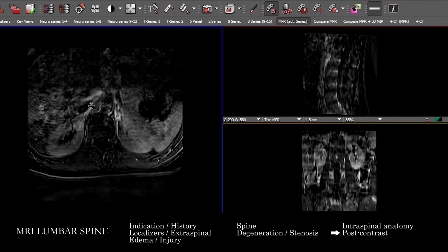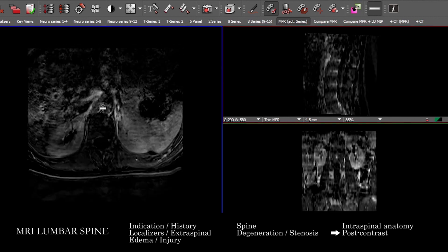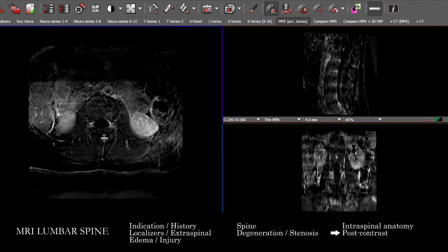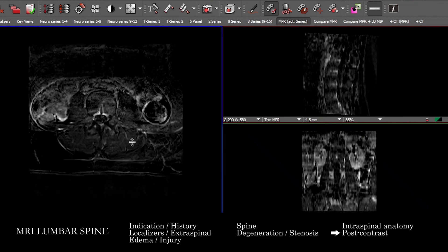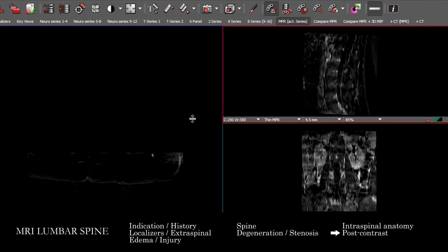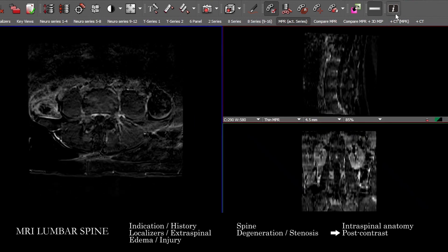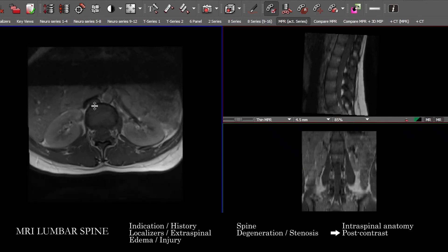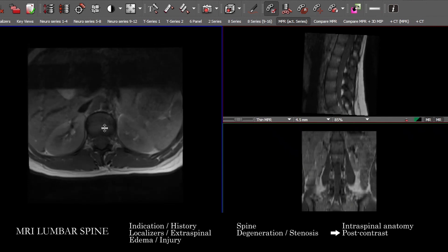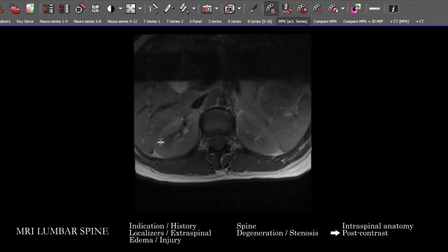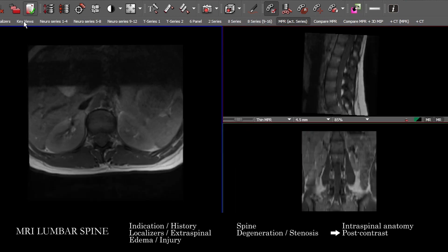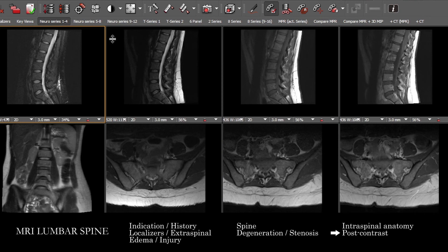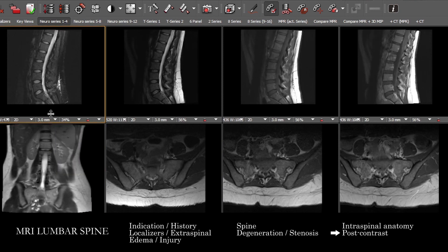The axials will do subtraction better. We can actually create subtraction images of the pre and post-contrast as long as they are both either fat-saturated or not. That basically covers our approach to the MRI lumbar spine.